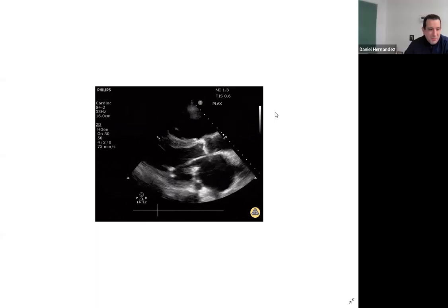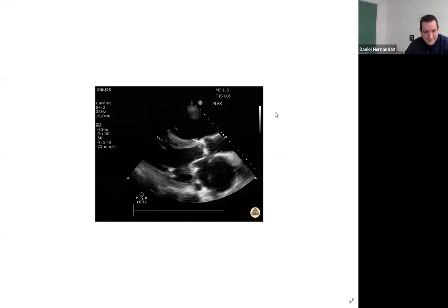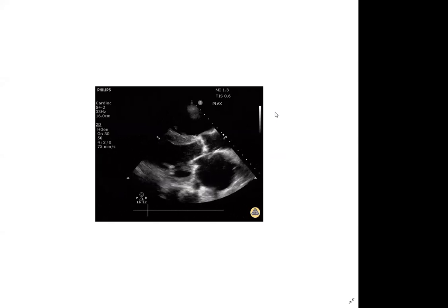Dr. Barrios, what would we be worried about with this patient? Something we would be worried about encountering. Thrombus development in the atrium because it's dilated. Definitely. I'm thinking if we were to go short axis, it'd probably look like pulmonary hypertension, like a D-shaped left ventricle because of the right ventricle. Yeah, it's big, it's dilated. Good.